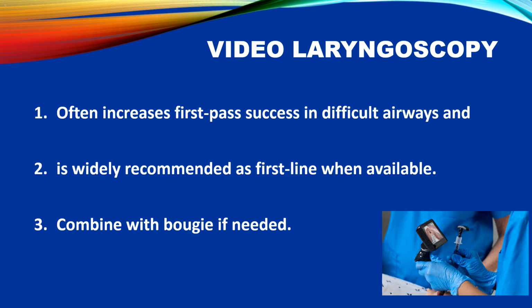Technique. 3. Combination with bougie. Can be combined with a bougie if needed to facilitate endotracheal tube placement. Improved visualization. Provides improved visualization of the airway, making intubation easier. Video laryngoscopy is a valuable tool for managing difficult airways, and its use can improve the success rate of intubation.